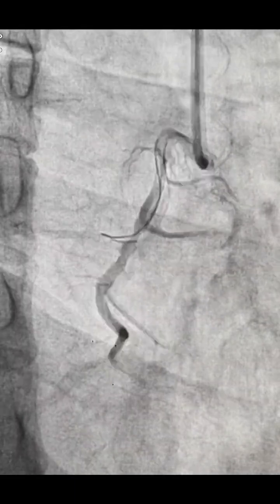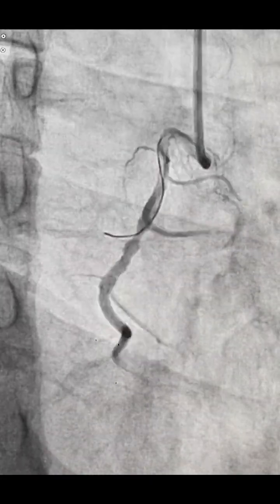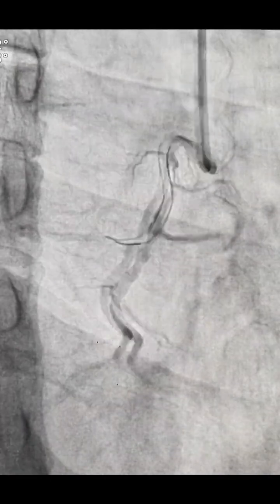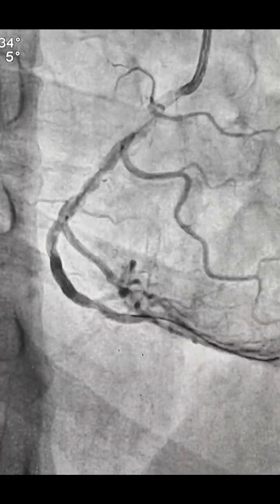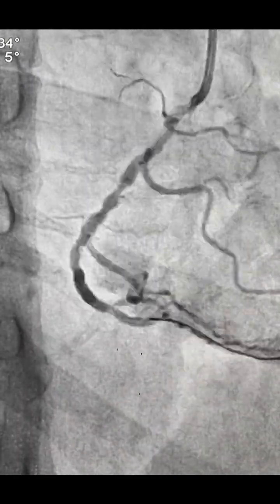It was a difficult task to put the wire with the JR catheter. This is a right radial route with the JR catheter, and I'm trying to put the wire into this Shepherd-Crook and tortuous RCA. You can see my wire is going. After 4 to 5 minutes, somehow I managed to place the wire in the RCA. And they presented on the third day of this angiogram with this chest pain.